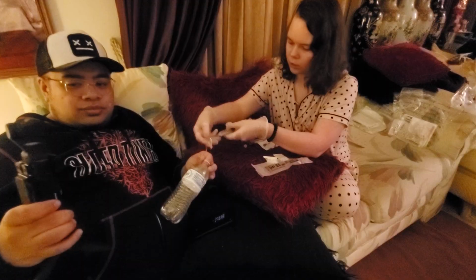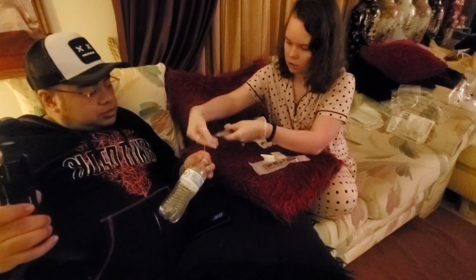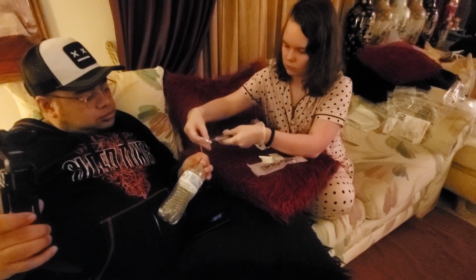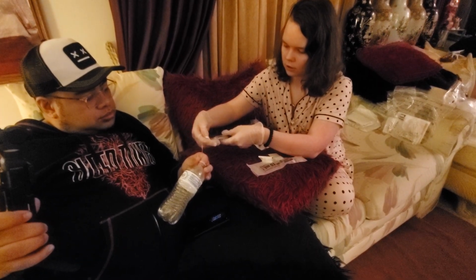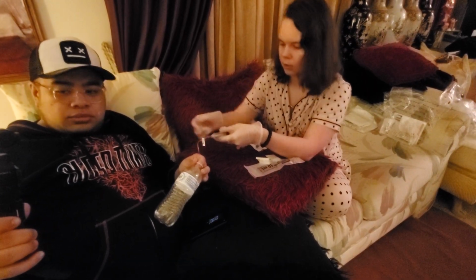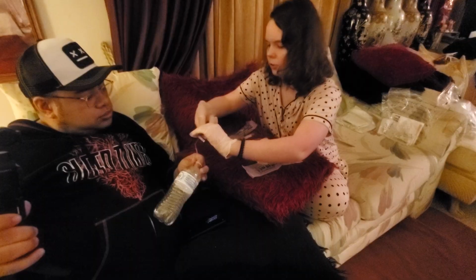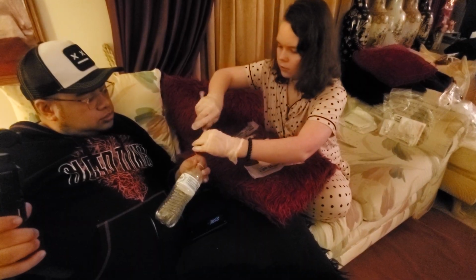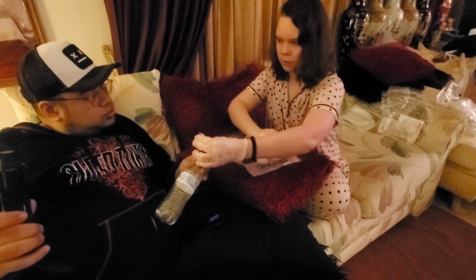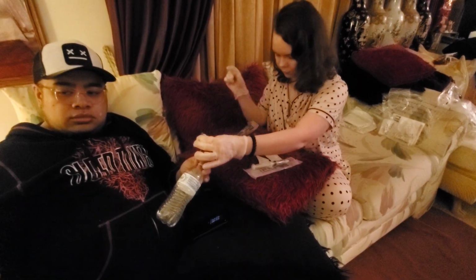I always struggle putting these back on when I'm wearing gloves. Maybe it's better if I turn it upside down like this, and there we go. Okay, that's the trick. That's what I need to do. Alright, so now I'm going to take this off, and this goes in the biohazard bag because it's got blood in it.